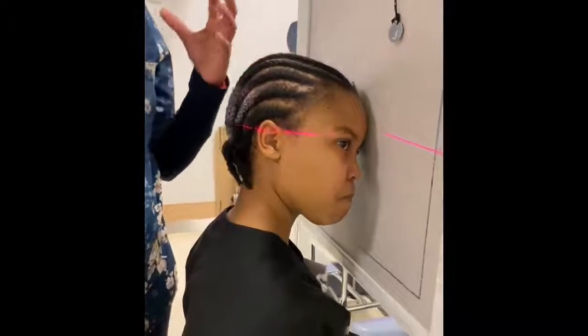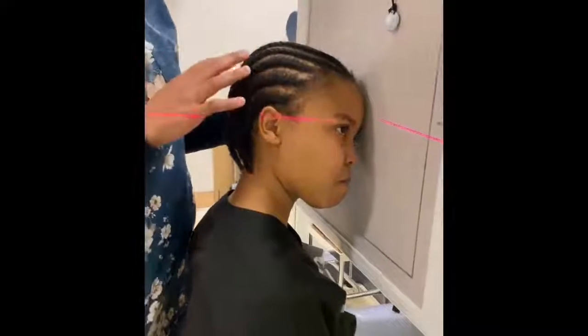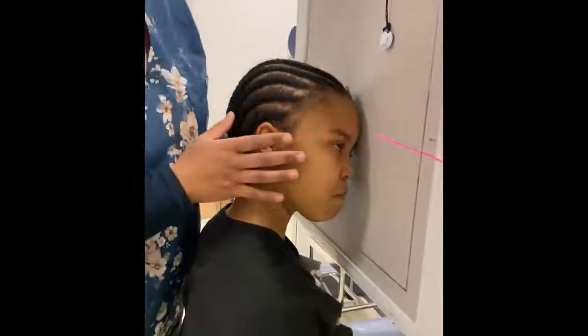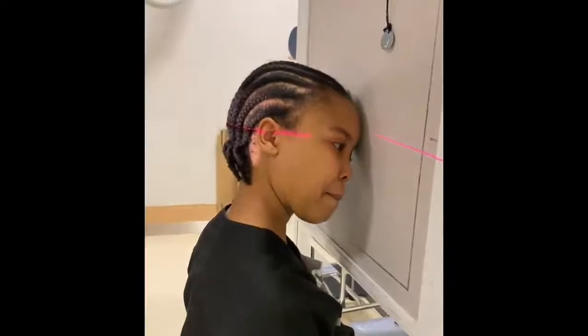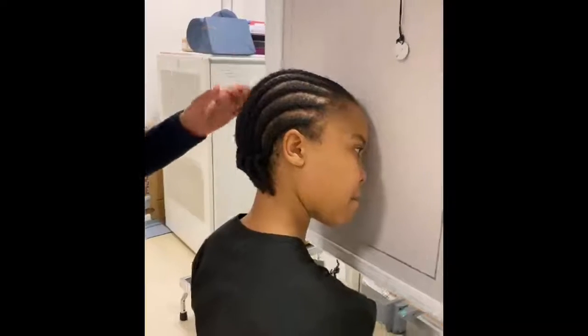If you have an angle indicator in your department, that would be great, you could use it. However, we do not have one here, so we're just going to assume that this is more or less a 37-degree positioning. Your centering for this patient, we are going to center in the mid portion of the downside orbit.